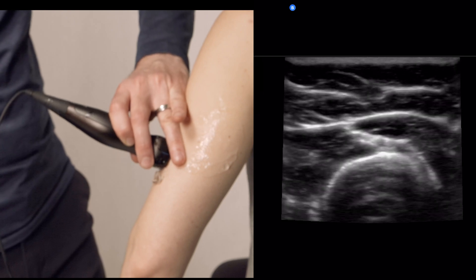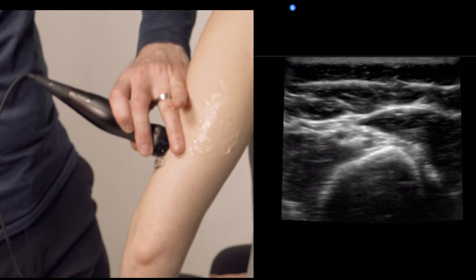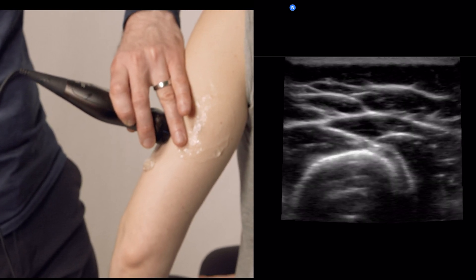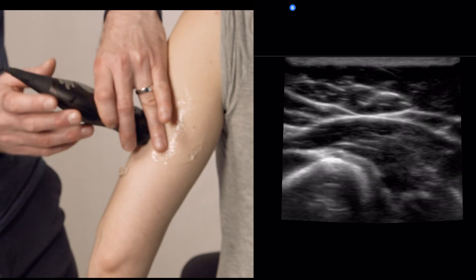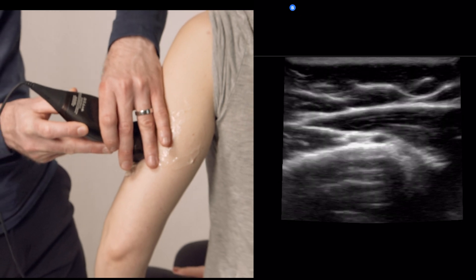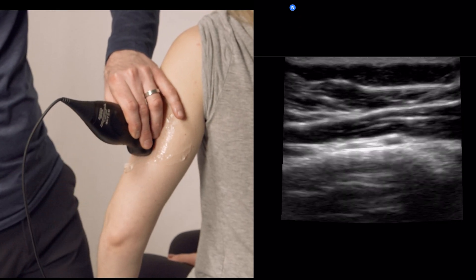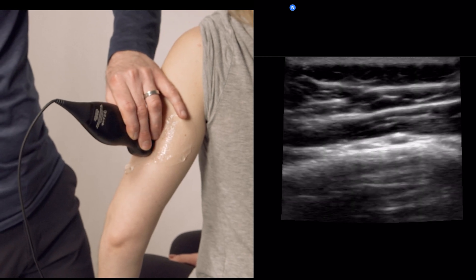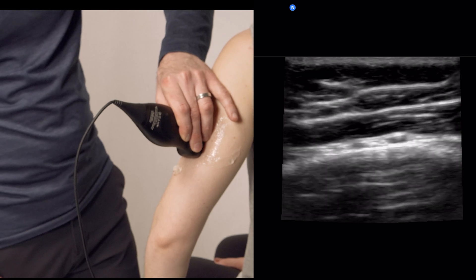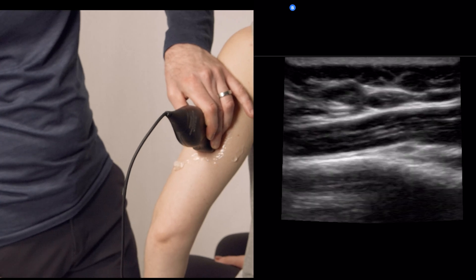Now that we've localized the nerve, we can see it here along with several vessels. We're going to follow these structures. The trick is to follow this in short axis. At this point we are right on the humerus at the spiral groove, and this is where you're going to find most of your pathology. So we're going to follow this along.